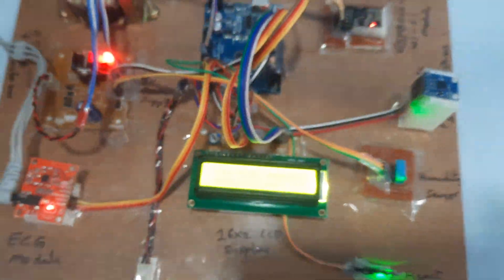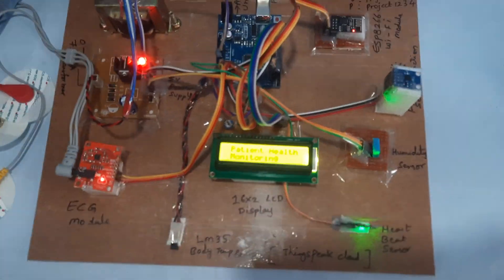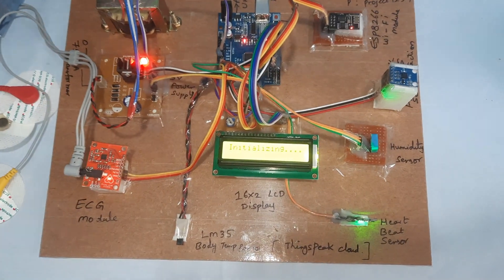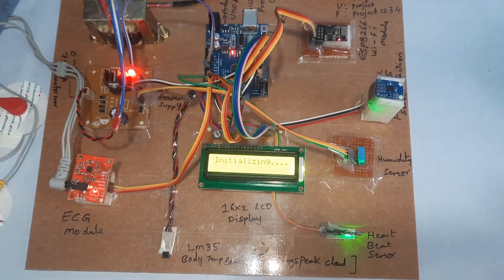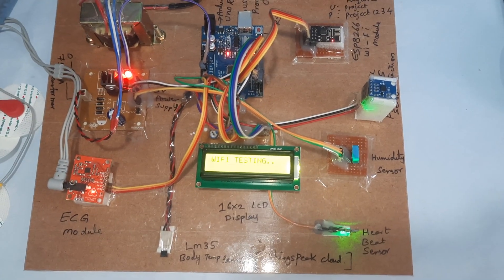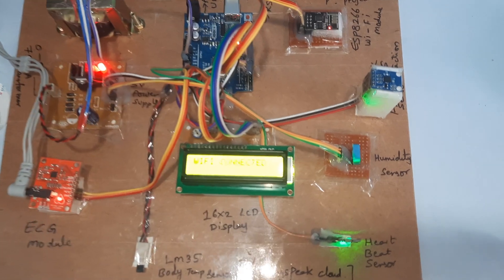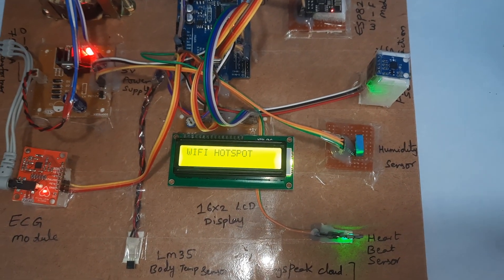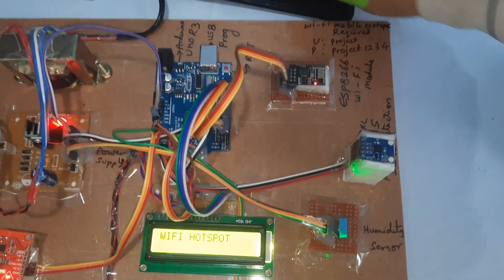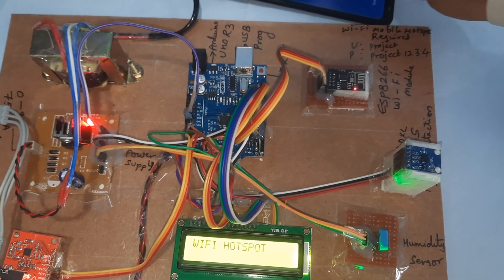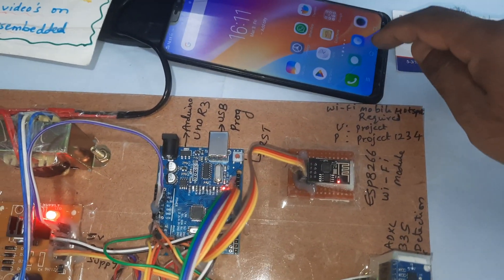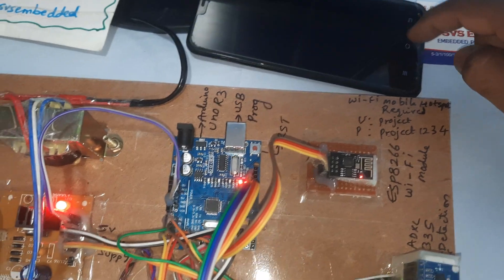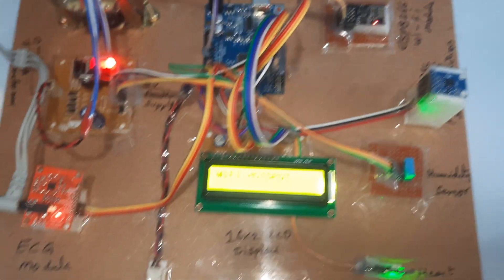Now I'm going to give the power supply. The Wi-Fi hotspot is being connected.